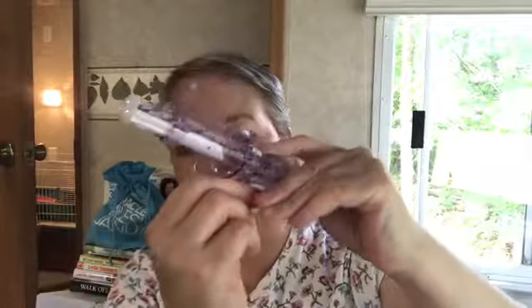And open this guy up, and this is what it looks like. Yes, it's a lot of waste, but unfortunately I have to do this. And you can see that this is curled down. What I do is I take them and curl them back just a little bit, so that way they will stay on. And there's 2 tabs on here, and I'll show you what that means.